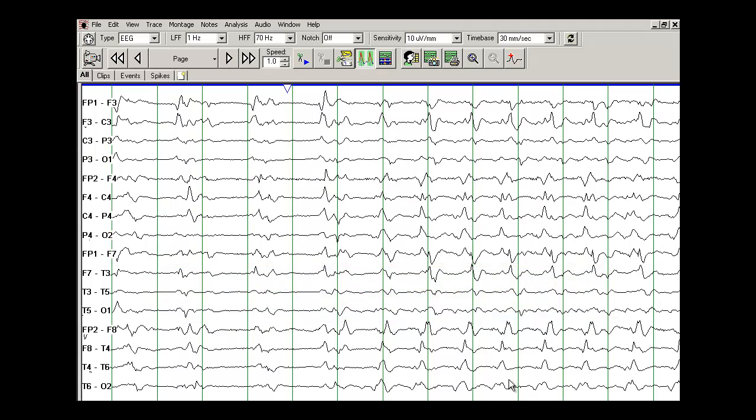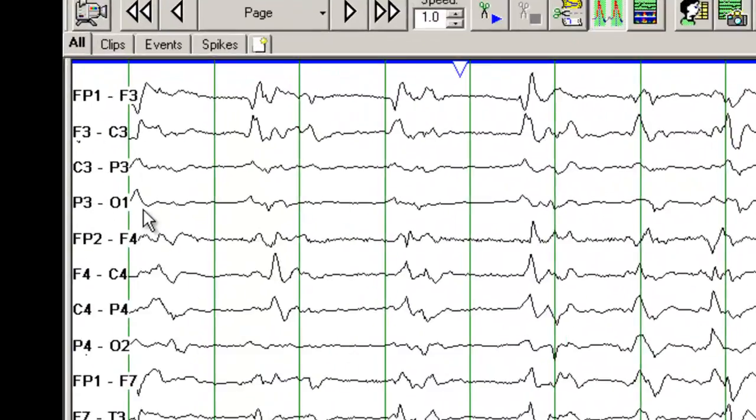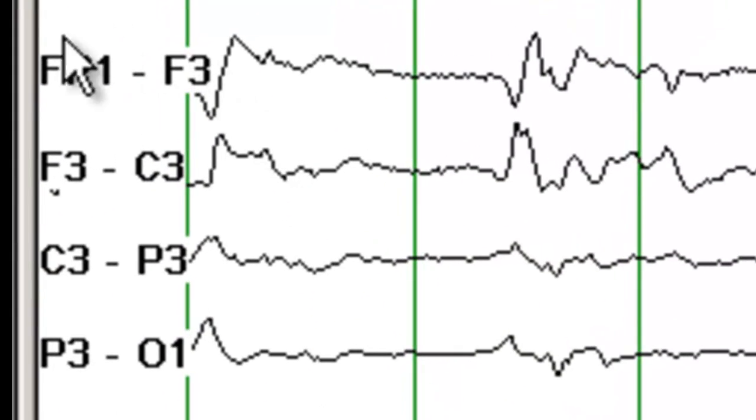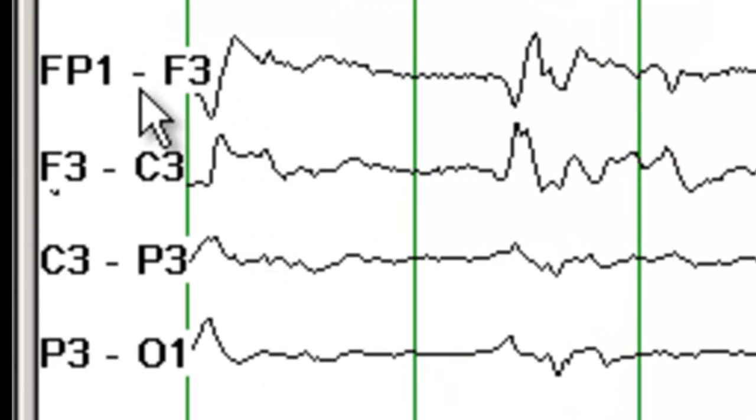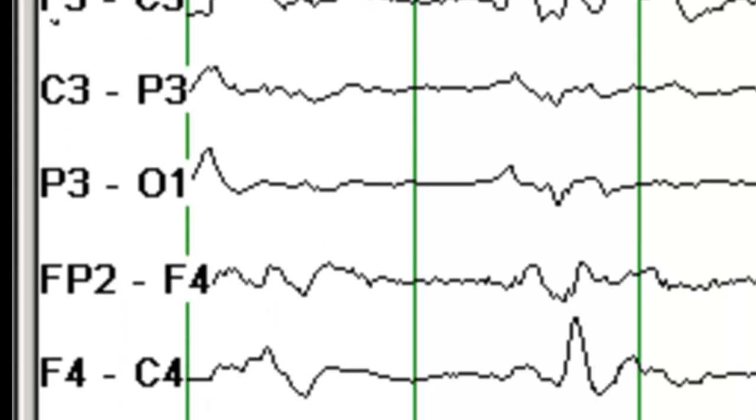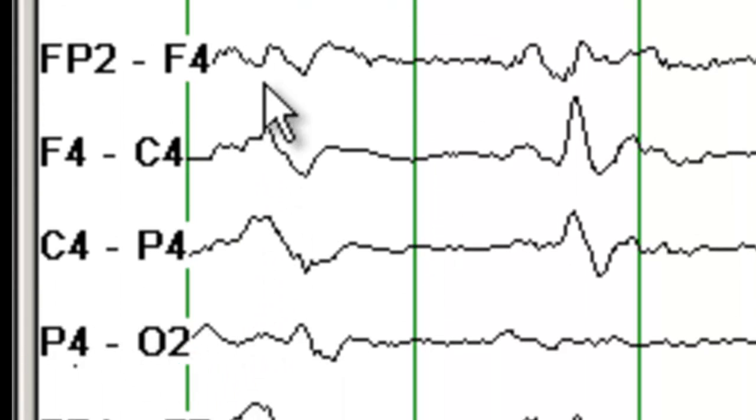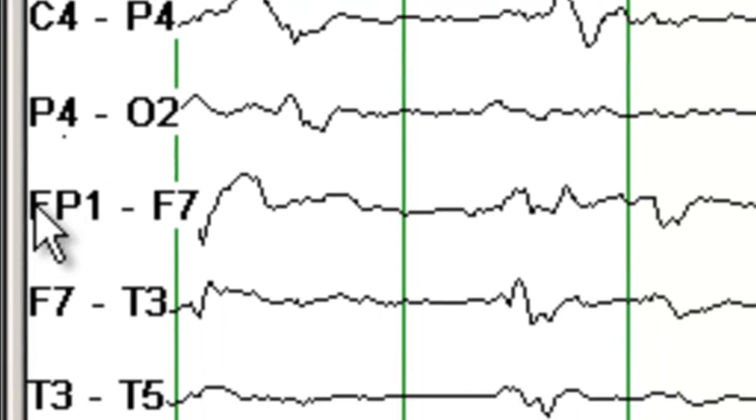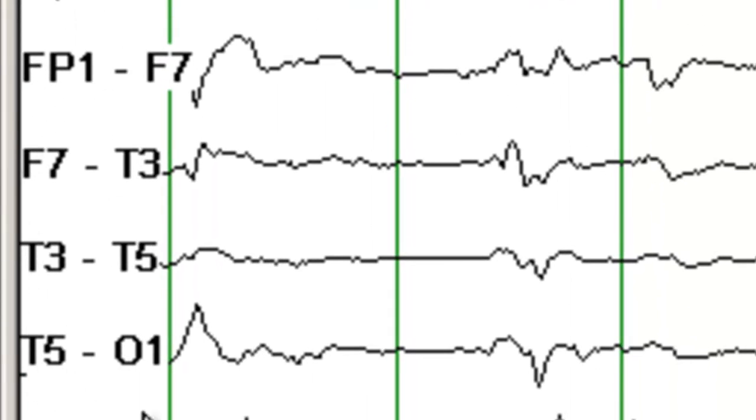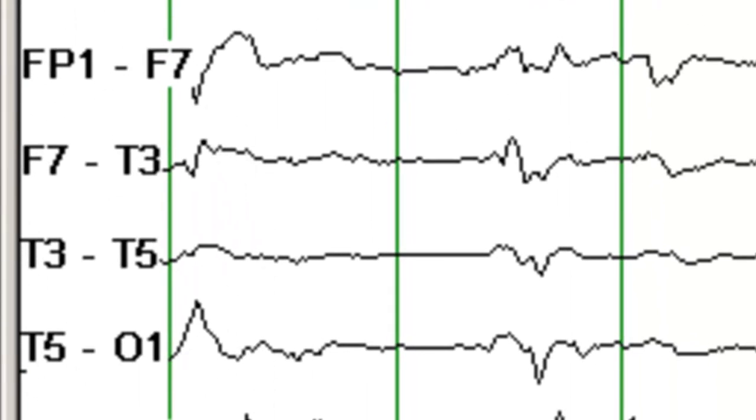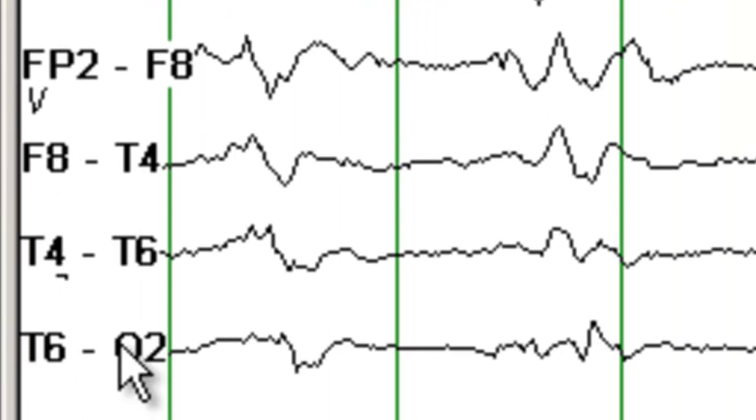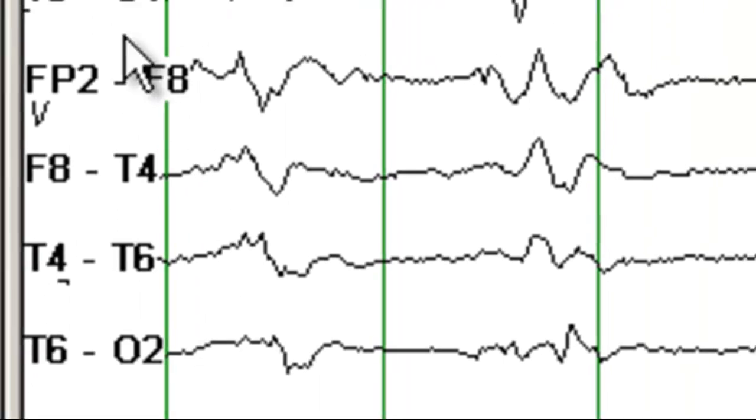Let's start with review of this EEG. You are looking at a bipolar montage, so if you focus over here, this is the left parasagittal electrodes recording from the left parasagittal area and this area is recording from the right parasagittal area and likewise this is the left temporal and right temporal head region.